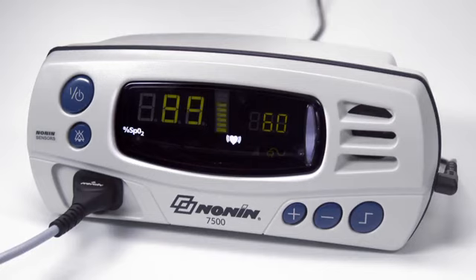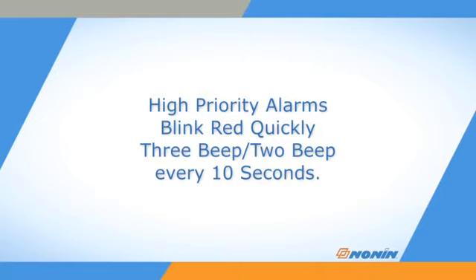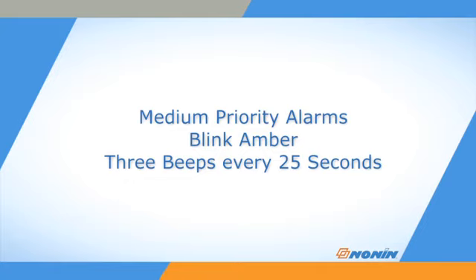Audible and visual alarms can be set to signal if either oxygen saturation or pulse rate go outside the predetermined ranges. Other oximeter functional conditions may also generate an alarm. For high-priority alarms, the alarm LED will blink quickly red and a 3-beep, 2-beep audible signal will repeat every 10 seconds. For medium-priority alarms, more often generated by an oximeter or sensor signal condition, the LED will blink amber slowly and 3 beeps will repeat every 25 seconds.